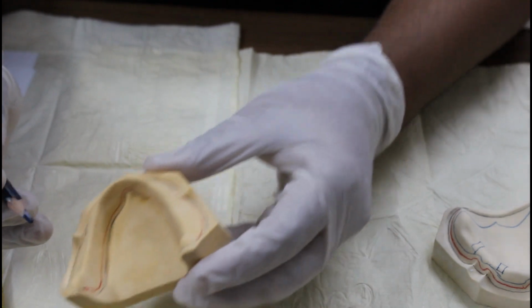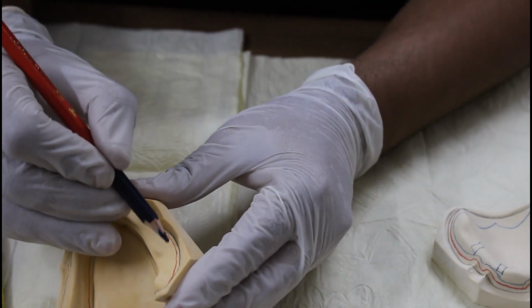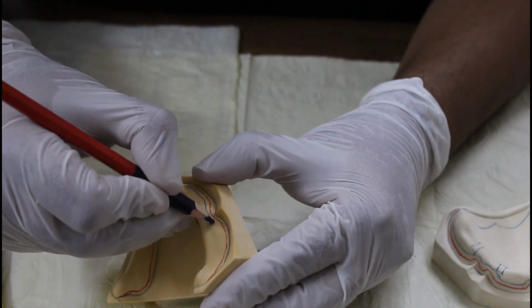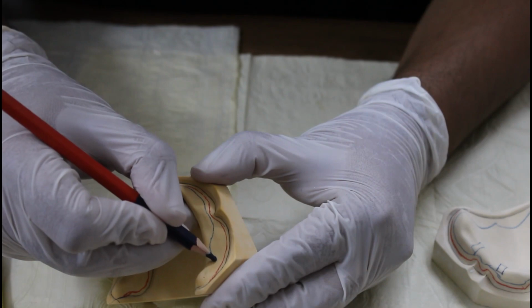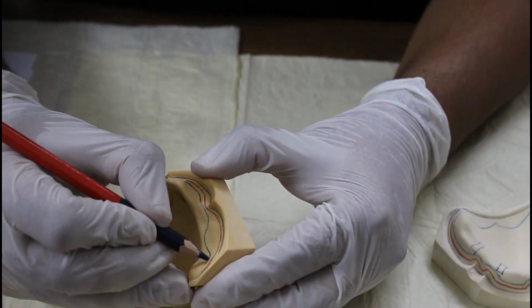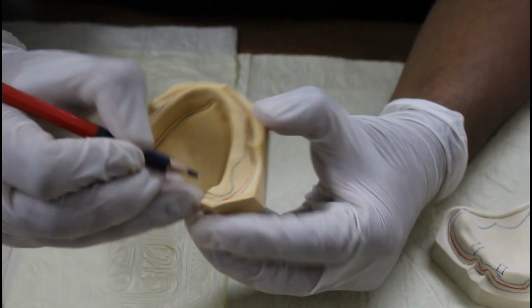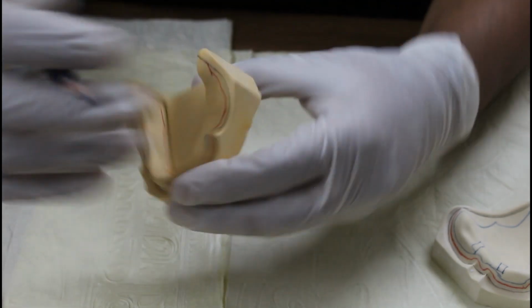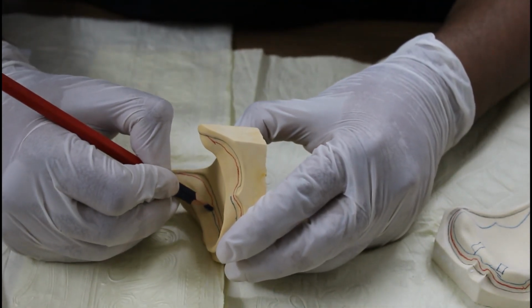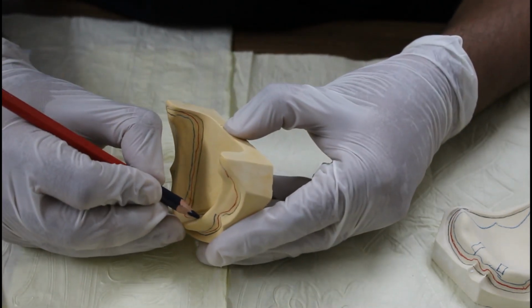Okay, the only difference here is in the buccal shelf area, the anatomical landmark, we know it is a primary supporting area. We will not cover it. We will leave it like this. We will not make the spacer on the buccal shelf area as this is a supporting area. On the lingual side, mark a line 2 millimeter above the red line.